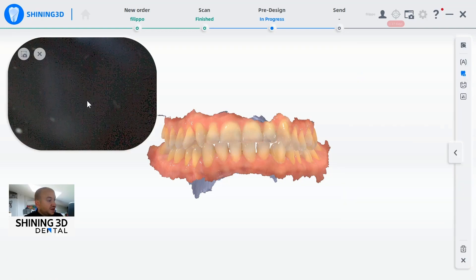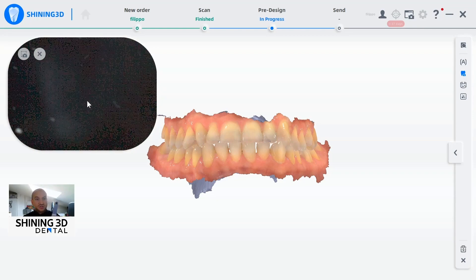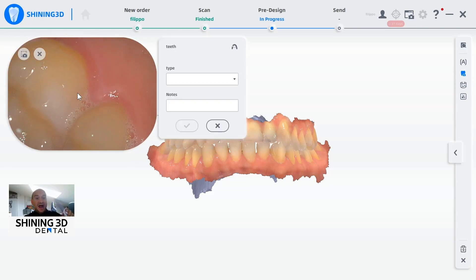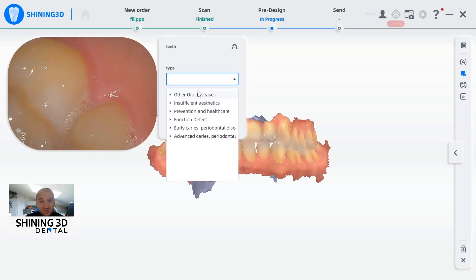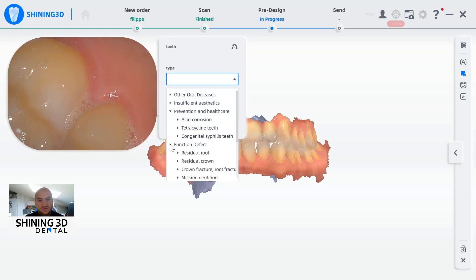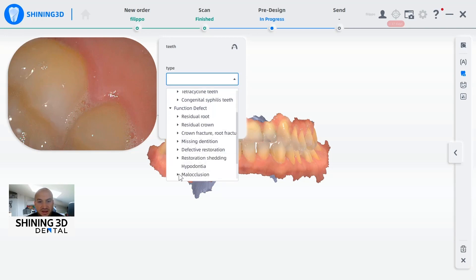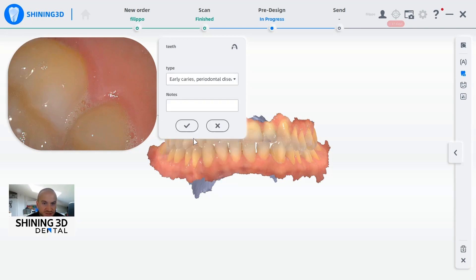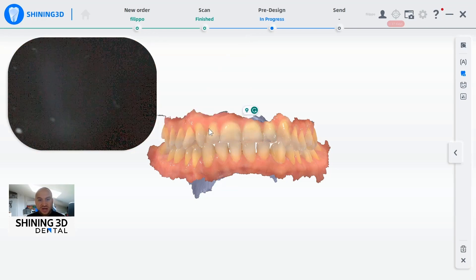We continue to have the endoscope tool available here in the oral health report. We can simply use the scanner as an endoscope in order to take pictures. By pressing the button on the scanner we can take a picture. We can choose between different options: function defect, insufficient aesthetics, and many more. There are a lot of sub-options we can choose in order to describe as precisely as possible what the doctor wants to highlight.